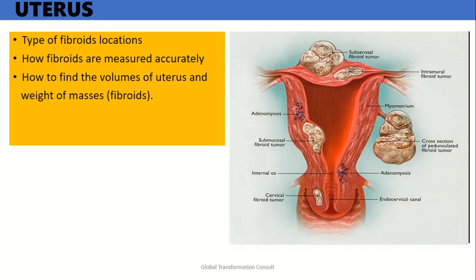The next is also further locations of fibroids. Typical examples, location of fibroids. These are not sonographic images, these are graphical images. So you can see the pedunculated one has a blood vessel connected to it. So this is feeding this fibroid with a lot of blood.